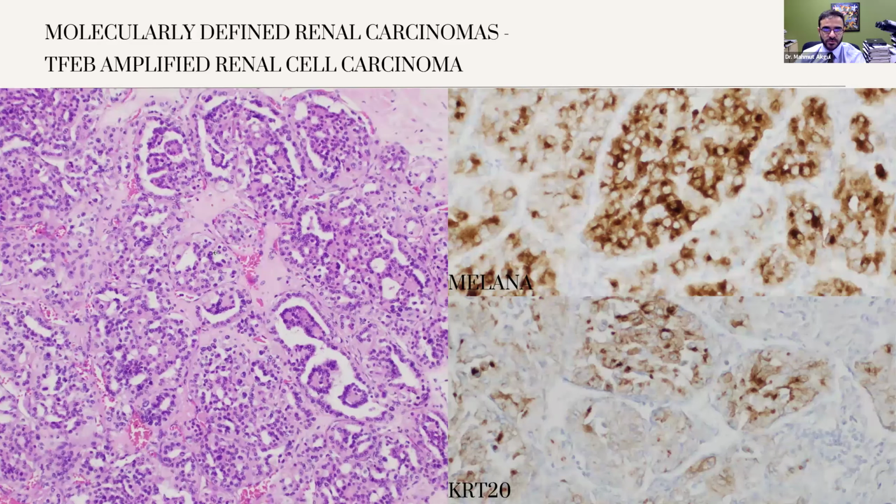After the molecular-defined carcinomas, I would like to talk a little bit about common tumors with high-grade infiltrative presentations. This case came to me last year. It was an adult male patient with kidney mass. He had a known kidney mass and multiple bone metastases.